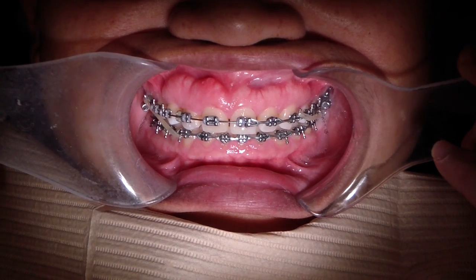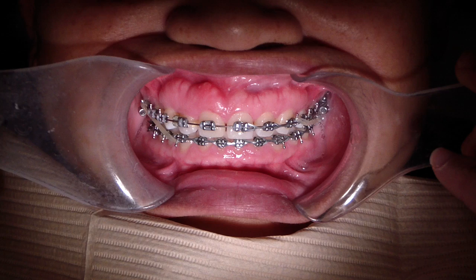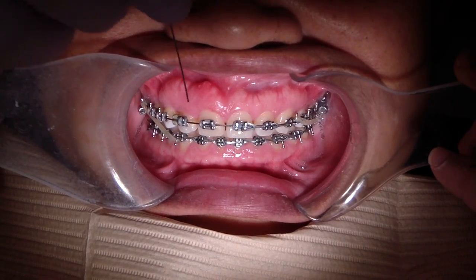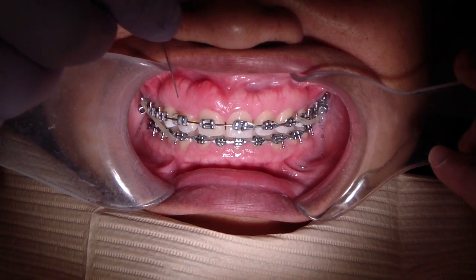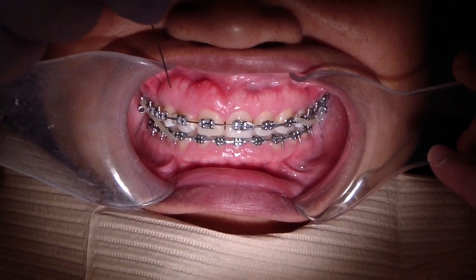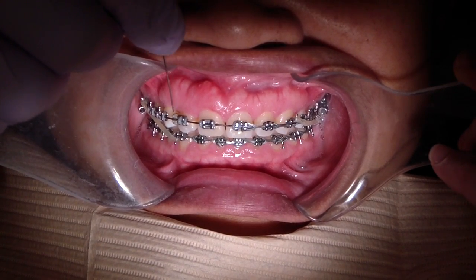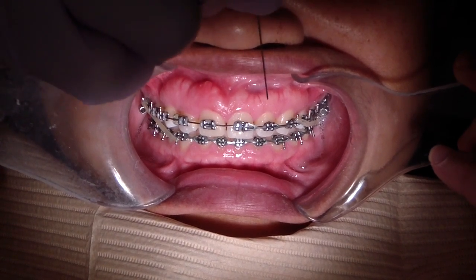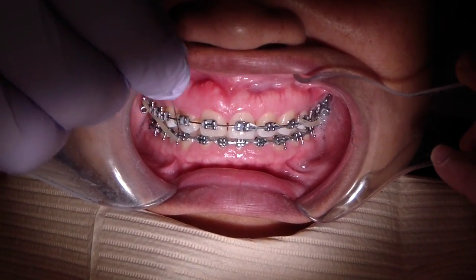We're continuing orthodontic treatment with patient MR. We're performing a midline shift — trying to move her maxillary midline to the left and her mandibular midline to the right. She had a buccally located ectopic canine which was extracted a number of years ago, so we're working with a lateral premolar as the terminal tooth as we execute this midline correction.